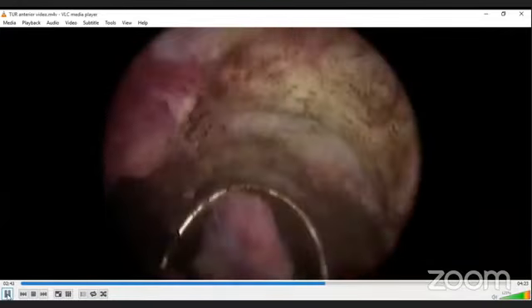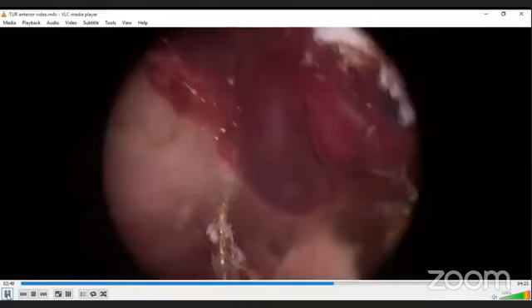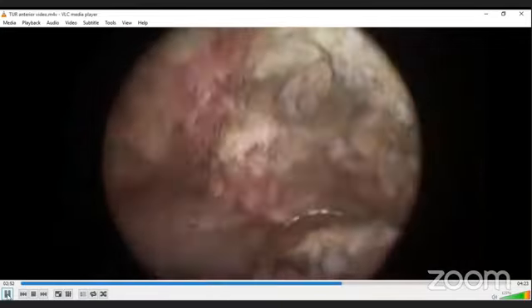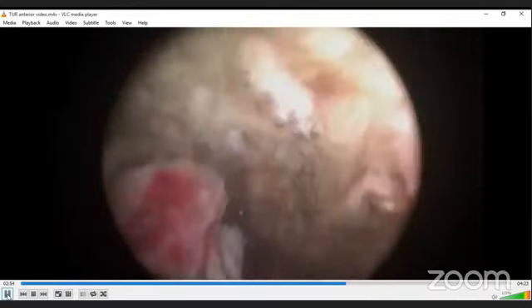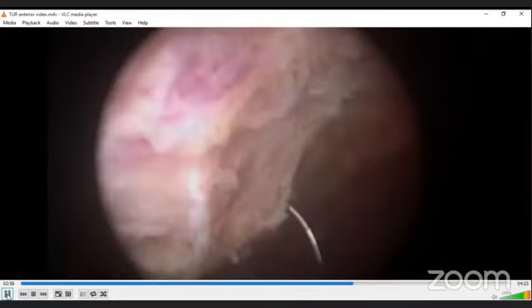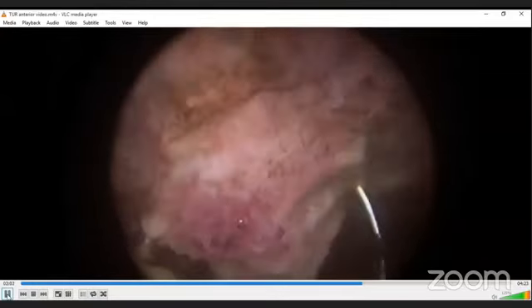Sometimes the bubble at the dome or the junction of the anterior wall with the dome can be present, and it may also trouble us. So the air can be removed manually, or by altering the position of the patient and the table, either head up low or tilt on either side.